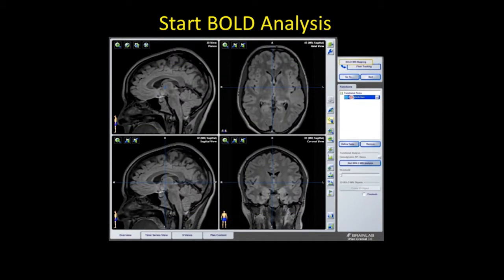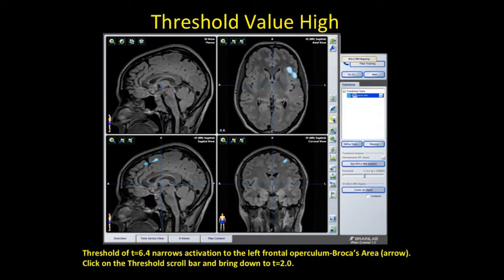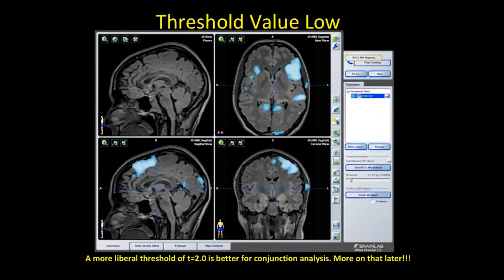Now we're ready to start our analysis. A statistical threshold — in this case 6.4 — narrows the activation to the left frontal operculum, otherwise known as Broca's area, highlighted here with an arrow. That's what we expect. But this may be too narrow a threshold, so we want to hit the scroll bar highlighted with the circle and bring our threshold down to 2.0, making it more liberal. A lower threshold is better for conjunction analysis, which we'll get to in a bit.